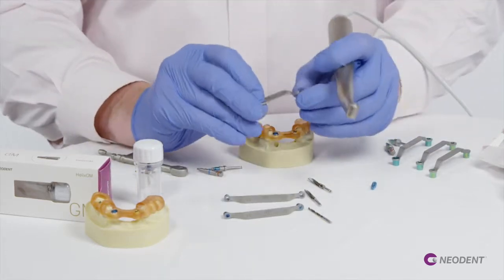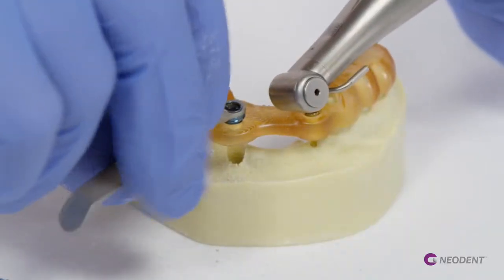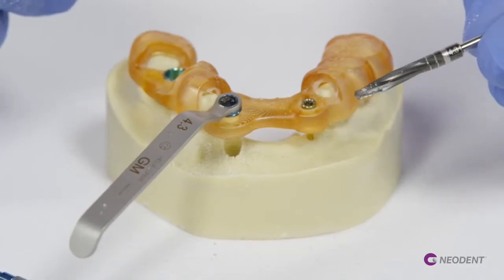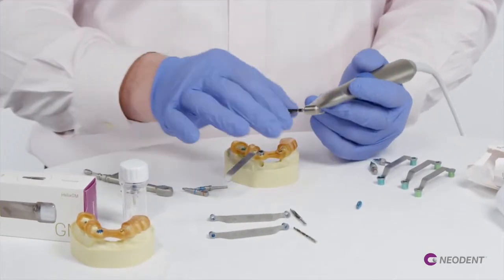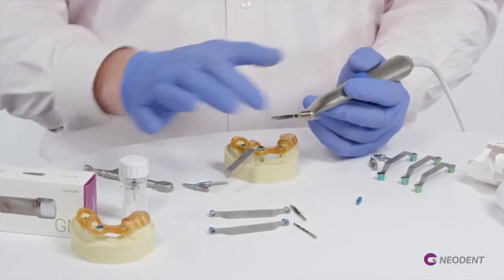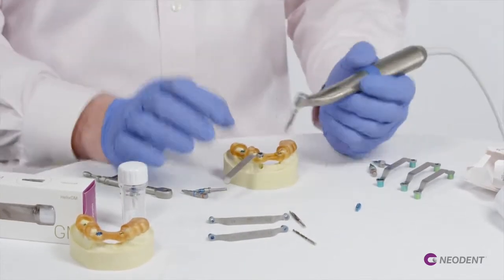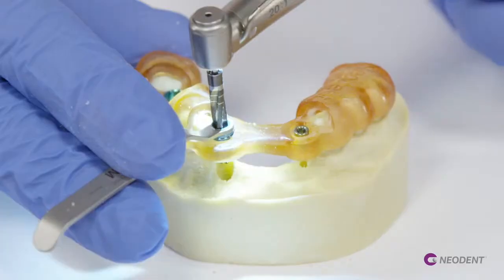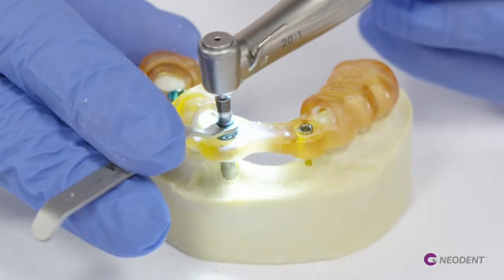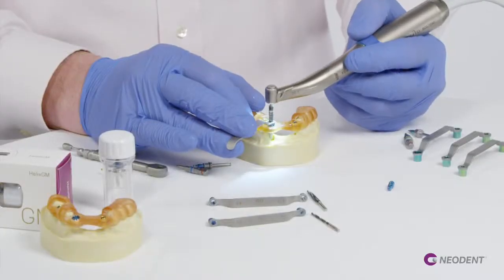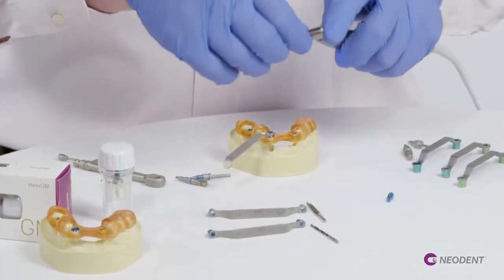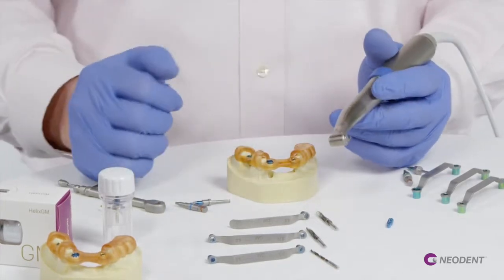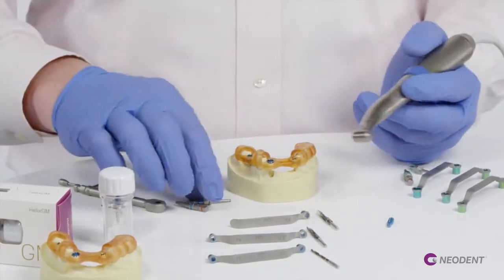We're transitioning to our third and last spoon which happens to be a 4.3 and we're placing our 4.3 drill into the handpiece. All of these drills, though they indicate it's a 4.3 drill, are actually undersized so it's not a 4.3 diameter. I want to get my drill passively placed down into my spoon with a little bit of a pumping motion and get this down to 11 and a half. Where we've drilled with our guided surgery system to that 11 and a half depth is where our implant is actually planned and placed.